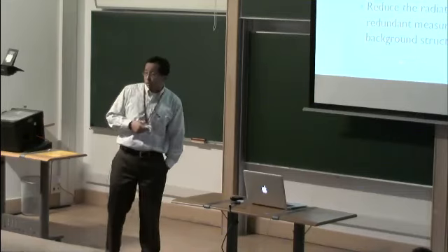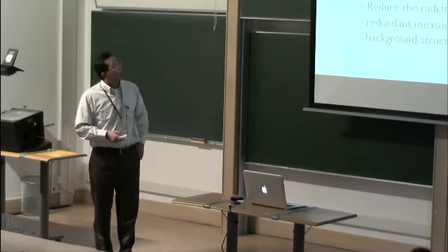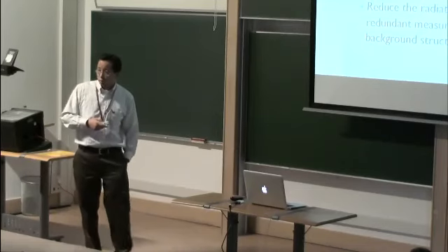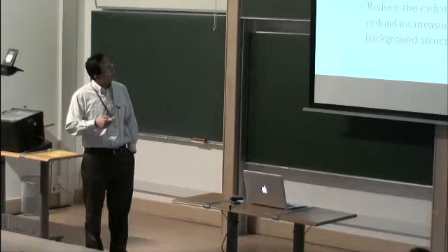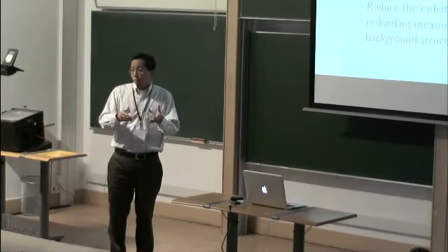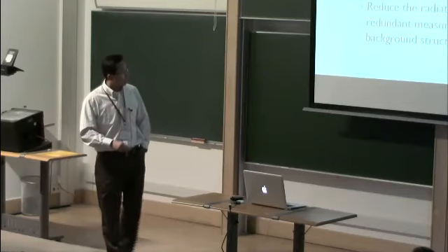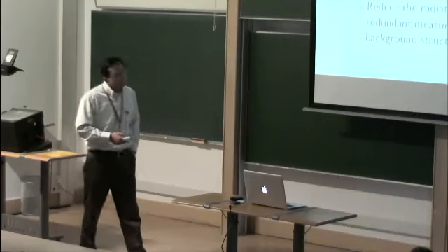Of course, the ultimate thing is that we're basically looking at similar situations. An extreme situation is if every time you're just taking a picture of the same stationary structure, then you don't have to take so many pictures. So hopefully, if you can explore this coherence, both temporal and spatial, you can reduce the measurements, which is equivalent to reducing the radiation dose. That's the ultimate goal, but you still get similar quality images. Or with the same measurements, you get better image quality.